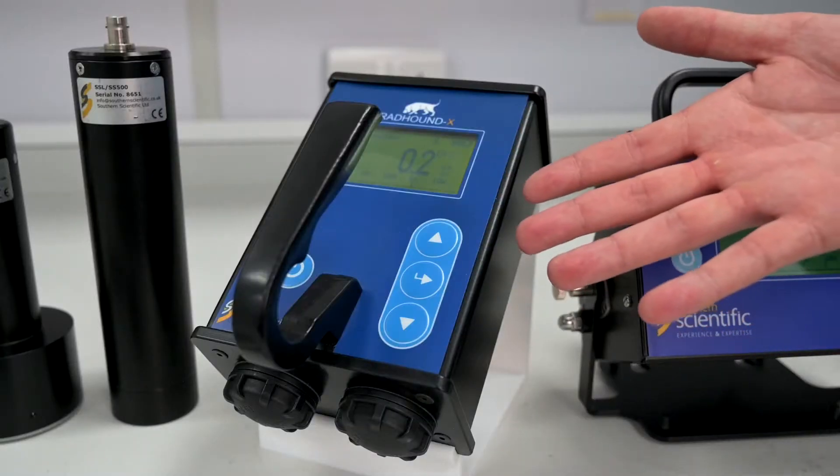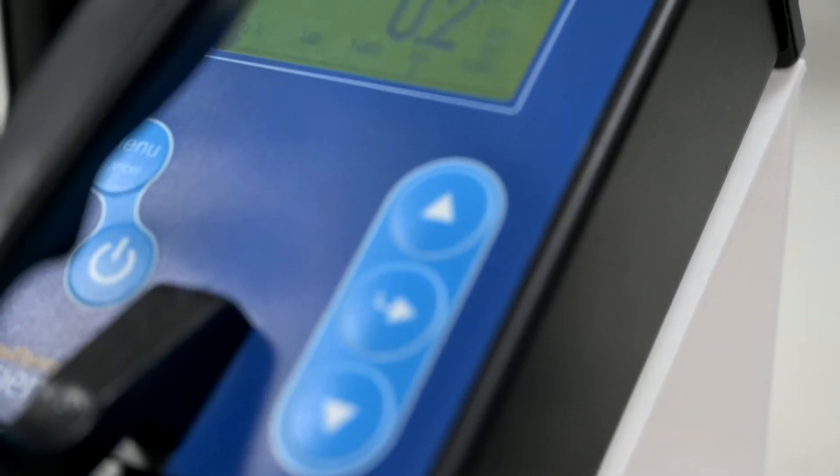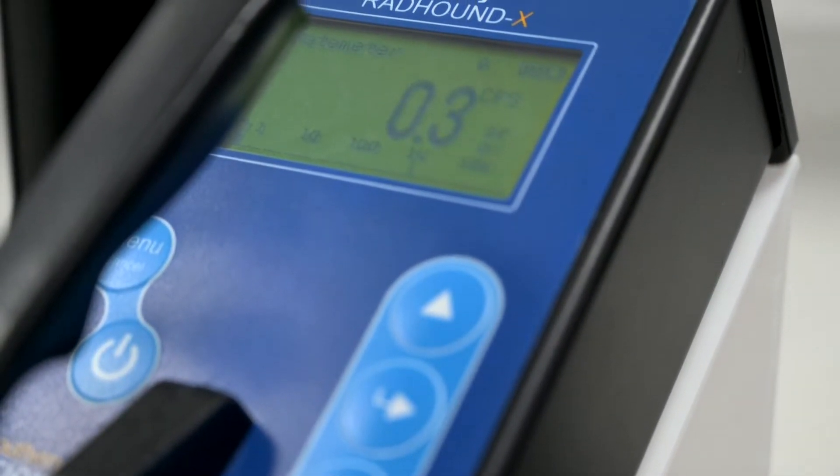Aside from the standard model of Radhound, there are also other versions available. The Radhound X is capable of storing a library of up to five different probes. It is a battery operated device and perfect for a dynamic site with lots of varied applications. The Radhound X335 is also one of our most recent launches. It uses an internal compensated end window Geiger detector, making it ideal for handheld dose rate measurements of gamma and x-ray energies.